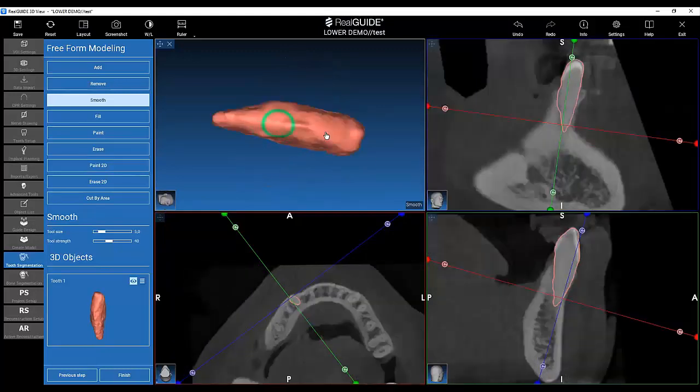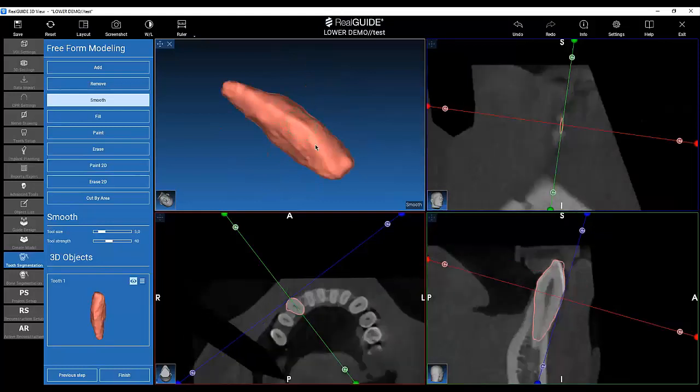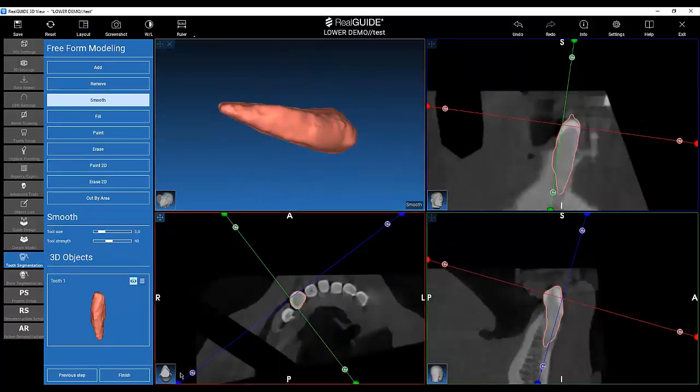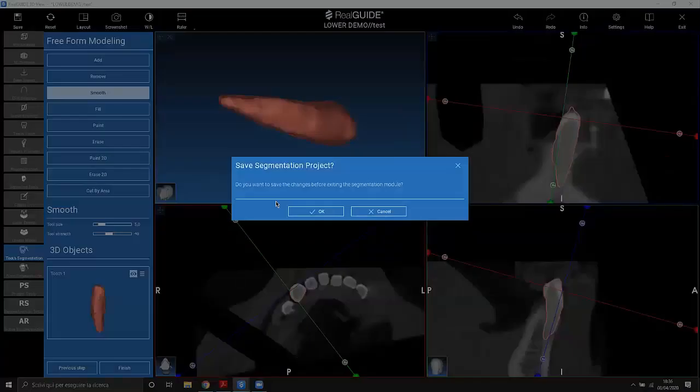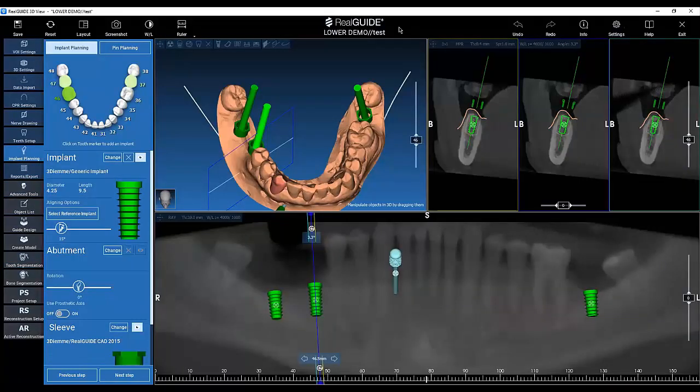I think only one, in order to see a full arch case, for example, or to answer all the questions. Right. Yes. Please consider also that on our website, if you go into the private area, you can find a lot of videos which show you how to manage the software, starting from the import data. I will show them to them.